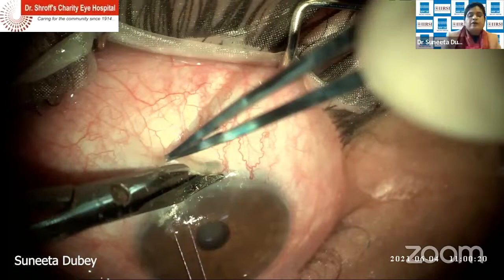Dr. Ganesh, you are saying superior nasal, superior temporal. What is the preferred site? Where should you perform first? My preference is I would usually go for the supranasal first, although many people say that it causes dysesthesia, and that's what you see in the literature also. But in my hand, somehow, it's not been a big problem. So I would try to place it supranasally first. Then I have more options. I can place the next one superiorly and go for a tube supratemporally. So I have my options open as much as I would like to. That's my take on that.